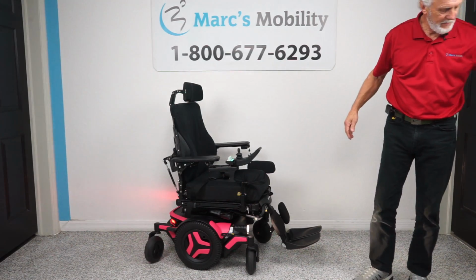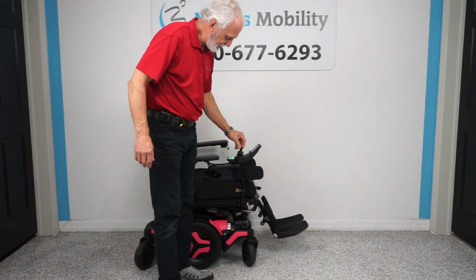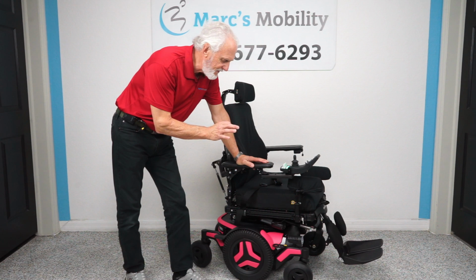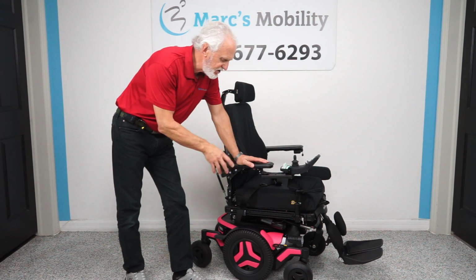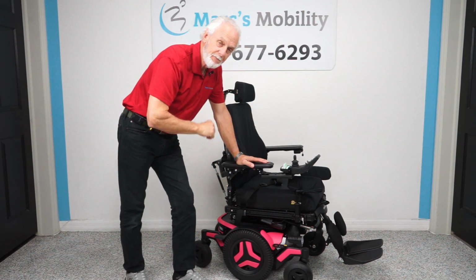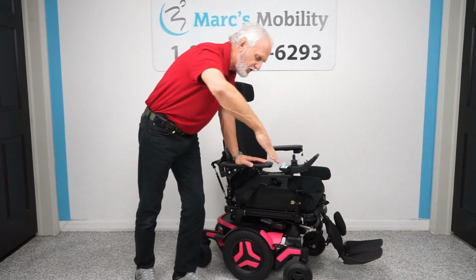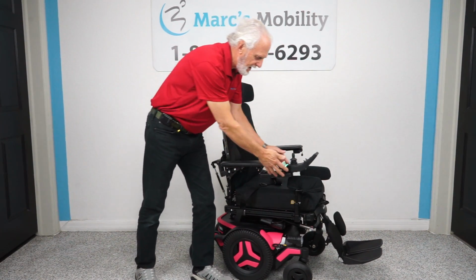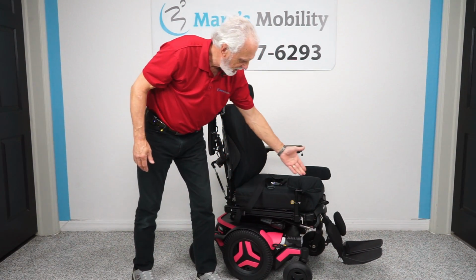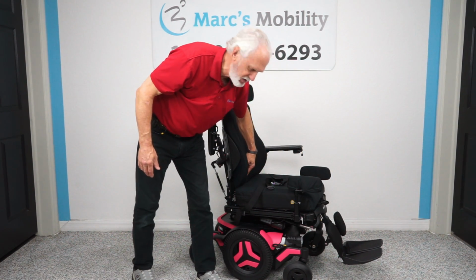So let's recap. We're going to turn the lights off so we don't blind ourselves. We have here a Permobil M3. The M stands for mid-wheel drive. This chair has 5 electrical functions: seat lift, tilt, recline, foot plates, anterior tilt. It has the swing away joystick, the flip up arm, the safety belt, the lateral knee pads, the USB port, the 18 by 20 cushion, which doesn't really matter.